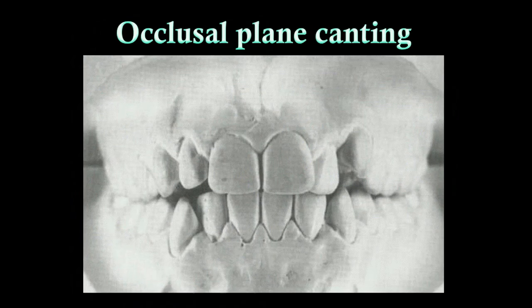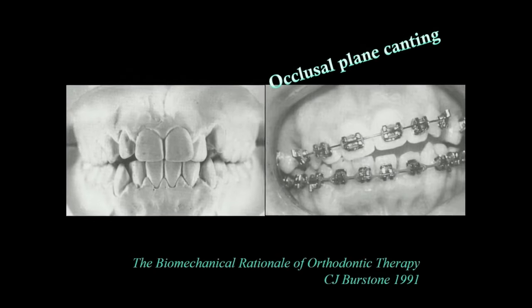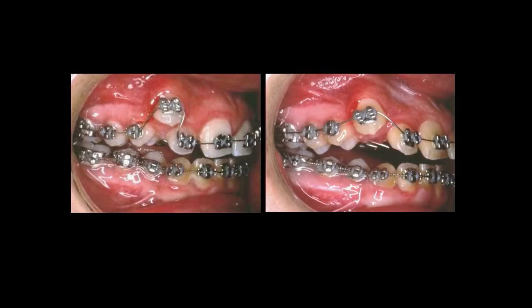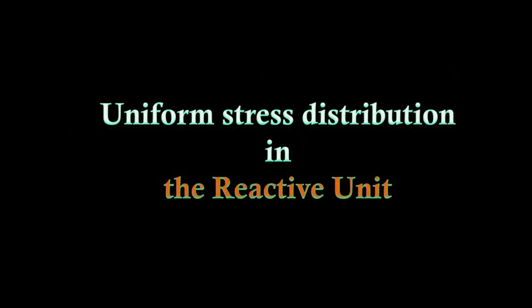One of the etiologies of occlusal plane canting is iatrogenic side effects that we make during the treatment. Segmental leveling of the anterior segment of a high canine produces unexpected occlusal plane canting. In this case, high canine leveling with continuous arch wire produced lateral open bite with canting of occlusal plane. If you don't find a proper place to eliminate side effects desirably, then the stress is uniformly distributed along the rest of the arch.